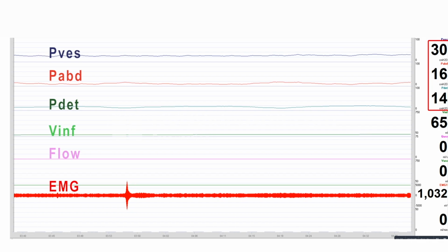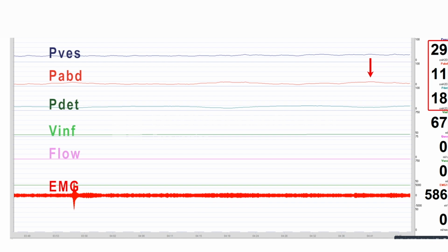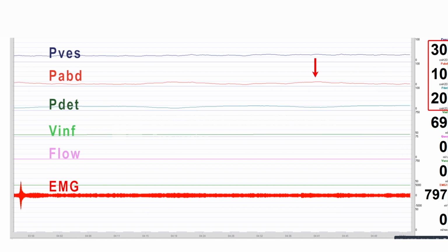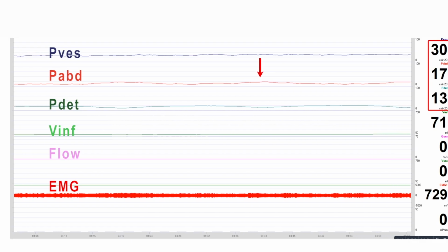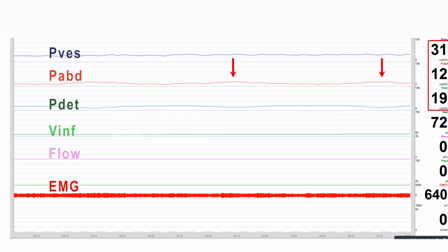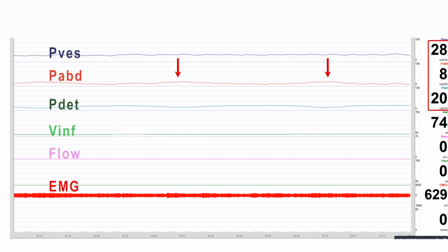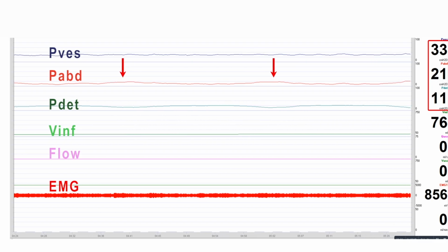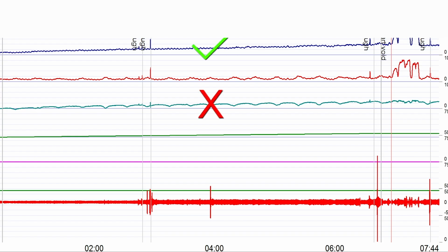In patients with neurogenic lower urinary tract dysfunction, neurogenic bowel dysfunction is not uncommon. During urodynamic study, rectal overactivity may be present, causing phasic pressure rises. In this situation, the detrusor pressure is no more relevant, and the observation of intravesical pressure becomes important and can inform about the bladder pressure situation.